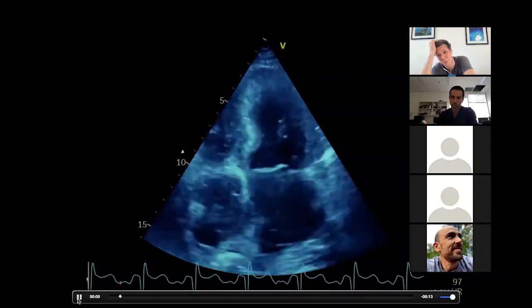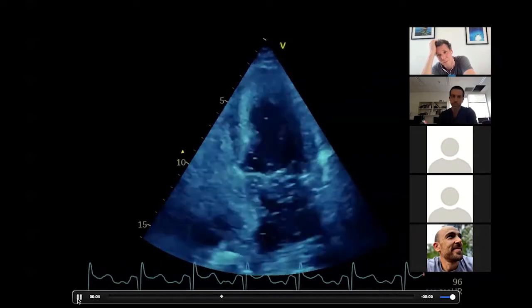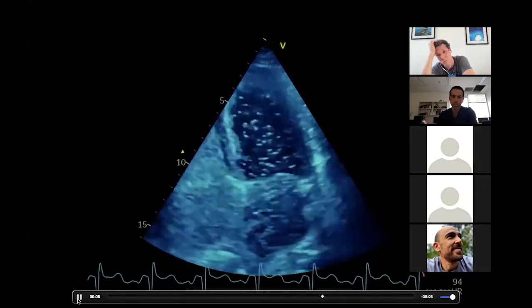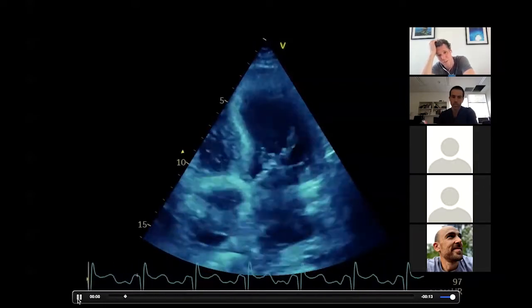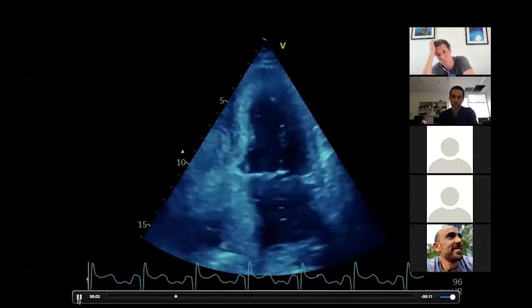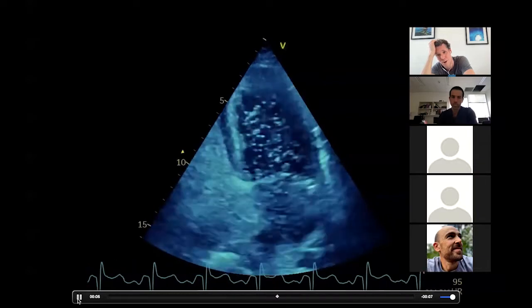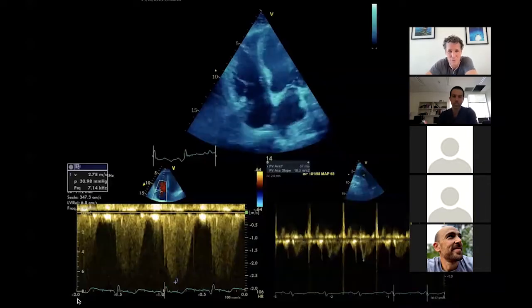And the last thing I'll just be talking about is the importance of the shunt, which means that we've got deoxygenated blood going from the right side of the heart to the left side of the heart. So it's also a relevance from the hypoxia side of things. Yeah. So absolutely. So we've caused right heart dysfunction. We've also caused a shunt to open up with the raised right atrial pressure. And therefore, we've got to look at trying to protect the ventricle.